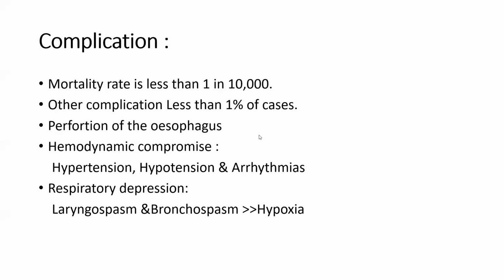But if the ejection fraction is low, for example, he has DCM and he has MR, and you want to know what is the cause of MR, you can give boluses of 200 cc, but with caution, of course.